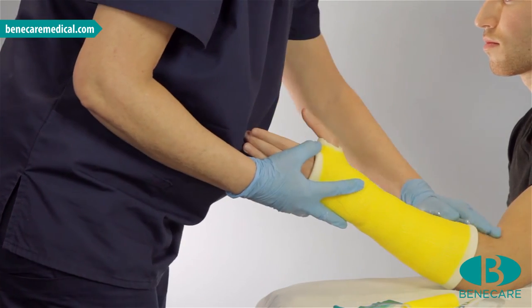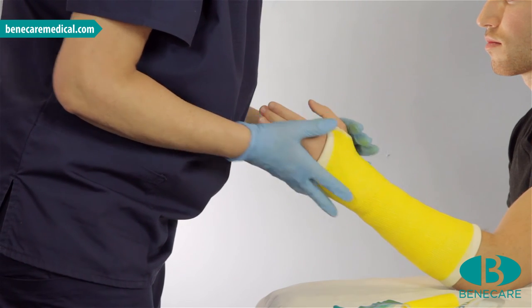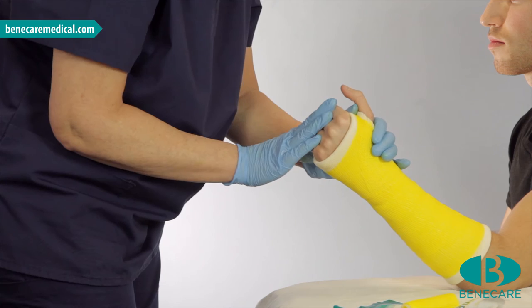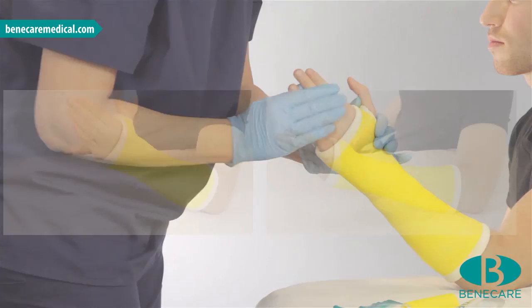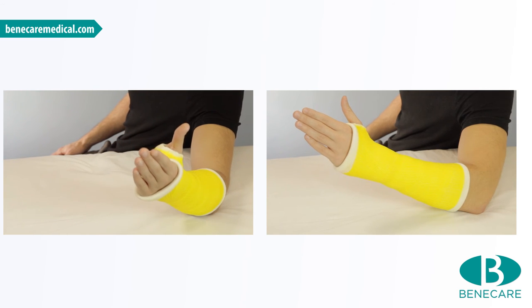As you can see, the patient has full function of the elbow, full range of movement of the thumb, and can bend the fingers to 90 degrees at the MCP joint. I will now give the patient written and verbal cast care instructions.